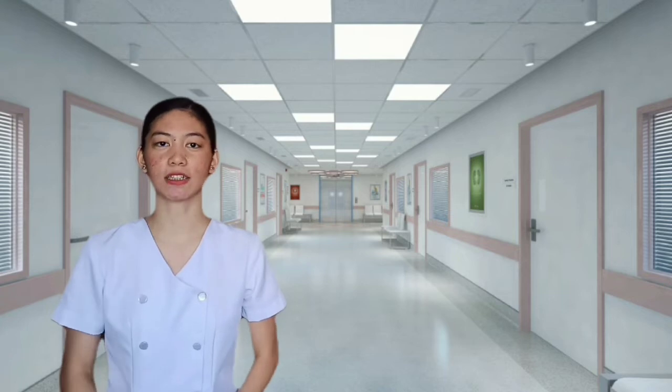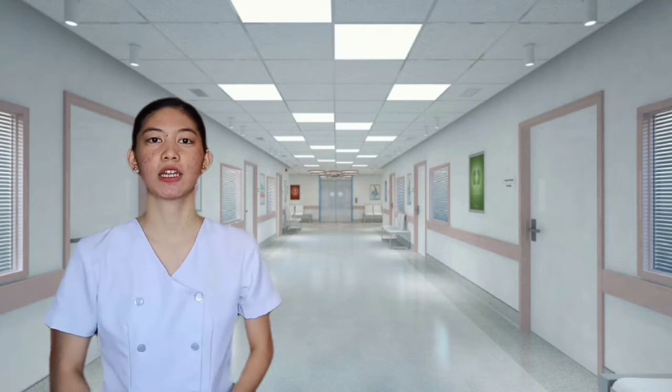If it is less than 32 weeks of gestation, there's at least 10 beats per minute and must last at least 10 seconds, or the 10 by 10 rule, unless previously demonstrated by the 15 by 15 rule.